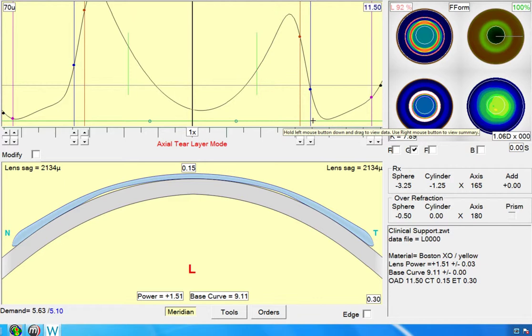Based on the video that was submitted, I think the edge profile is okay, or the sag at the edge is okay. So we just want to increase sag here at the back edge of the reverse curve. So even though it's only one quadrant, we're in a GSIM design, and I think it's okay to make this change all the way around.